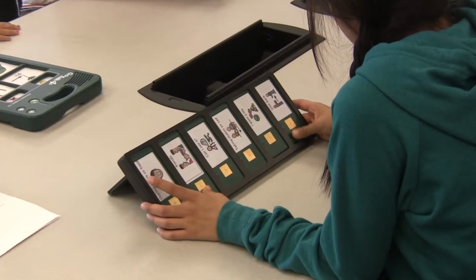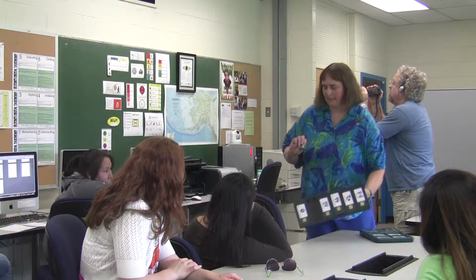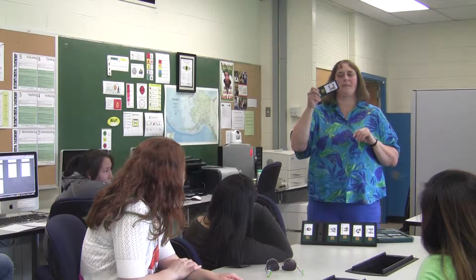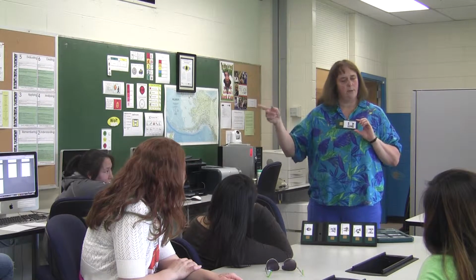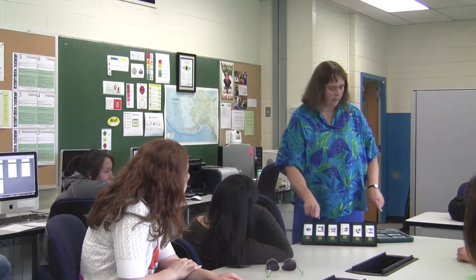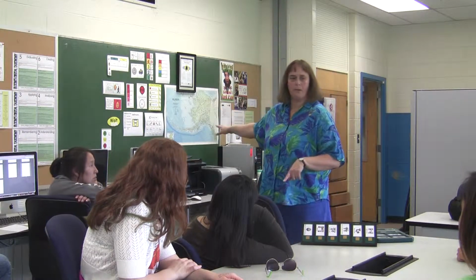Because first of all, if it's sitting like this, the pictures are going to be hard to read for the student. So they said friends are good, but if it's someone's voice, they might say, I want to talk to my friend, or friend, come here, something like that. So you can put them in 1, 4, or 9. So those are the GoTalks and the Boardmaker Pro.